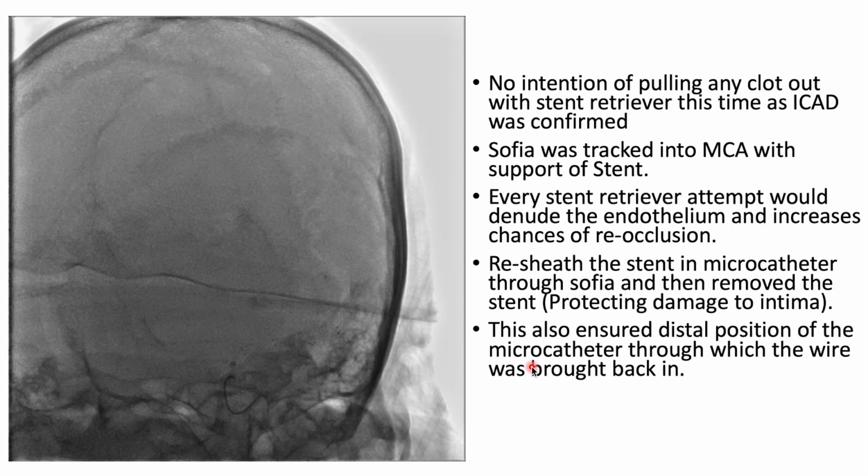So the next thing we did, I knew now that in order to deliver this balloon, I have to first deliver my Sophia Plus into the MCA. So I used the anchoring technique.